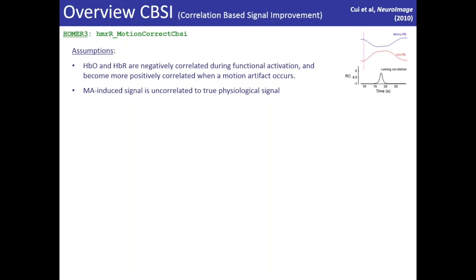So another motion correction method is correlation-based signal improvement. It has two major assumptions. Sorry, it was introduced by Dr. Kui. So going back to assumptions, the first assumption is that oxy and deoxyhemoglobin are negatively correlated during functional activation and become more positively correlated when a motion artifact occurs. And the second assumption is that motion artifact induced signal is uncorrelated to true physiological signal.